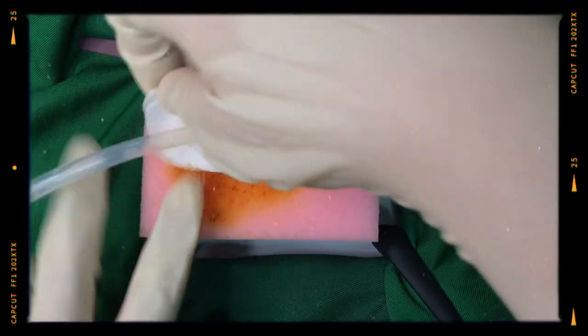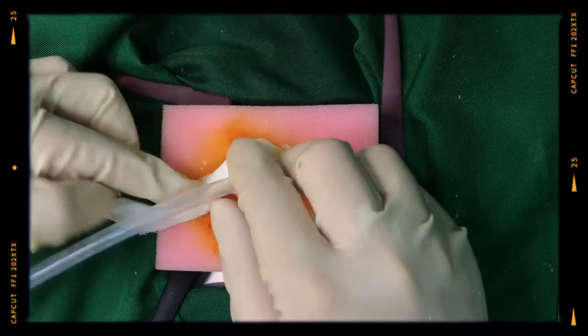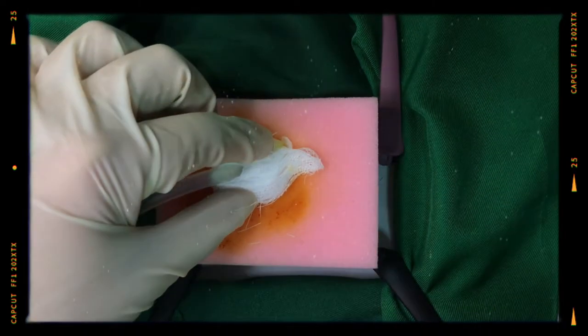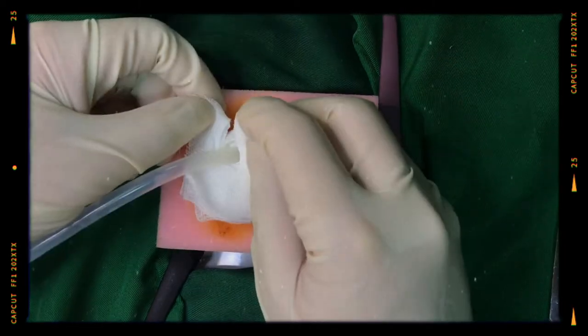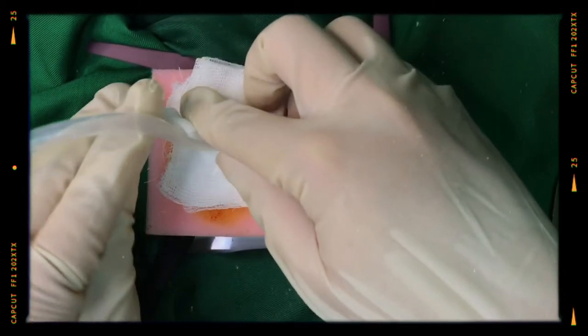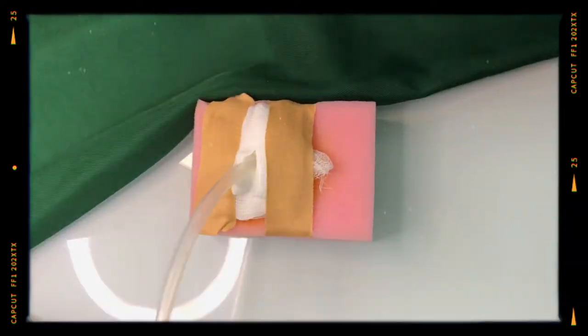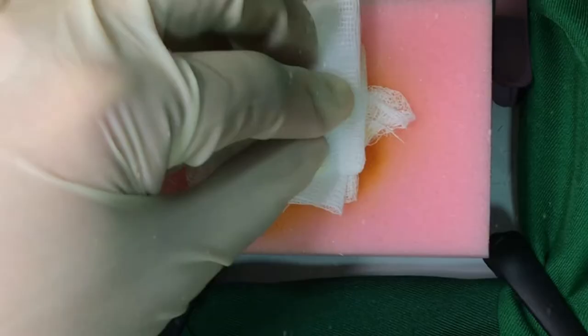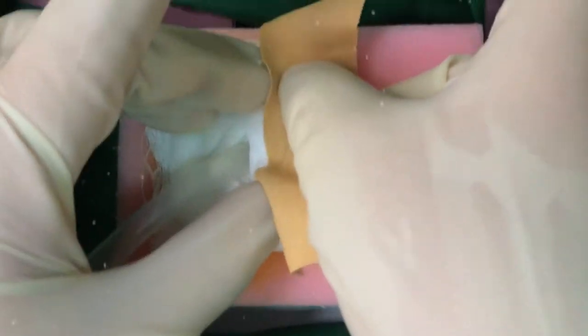Place vaseline gauze dressing around the tube and push it against the wound to prevent air leaks. Dress the wound with several pieces of sterile gauze around the tube. Remove the drapes and do after care. Secure the gauze in place with a plaster.